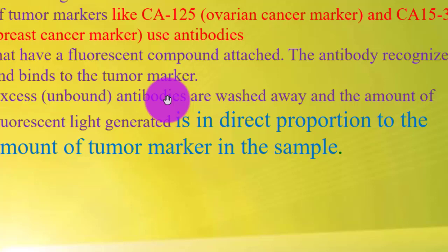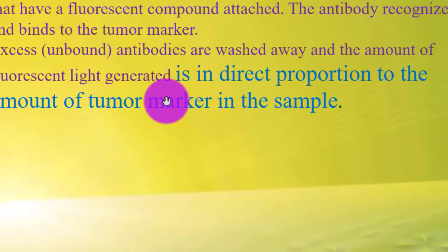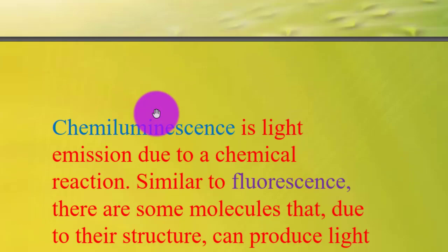The antibody recognizes and binds to the tumor marker. Excess unbound antibodies are washed away, and the amount of fluorescent light generated is in direct proportion to the amount of tumor marker in the sample.